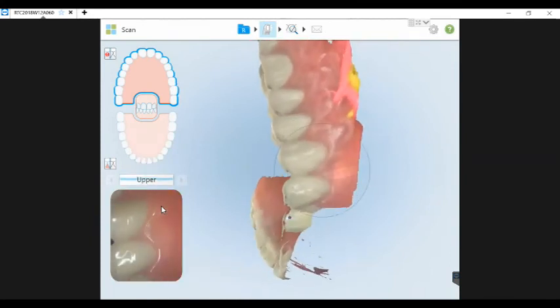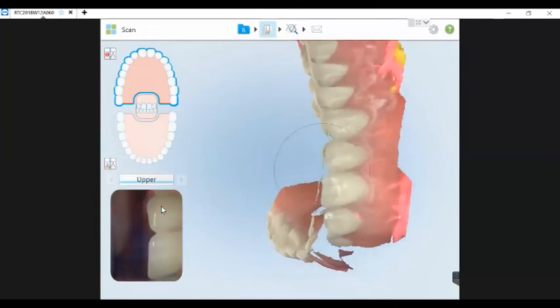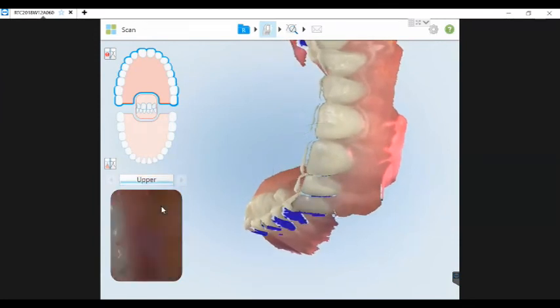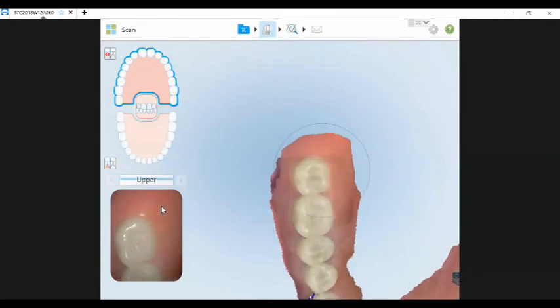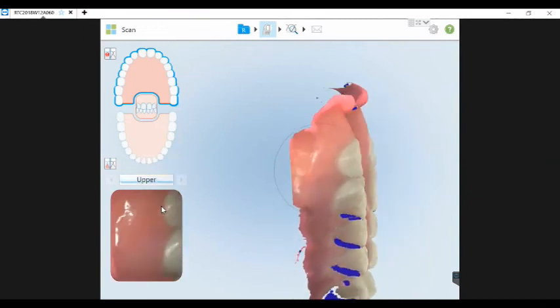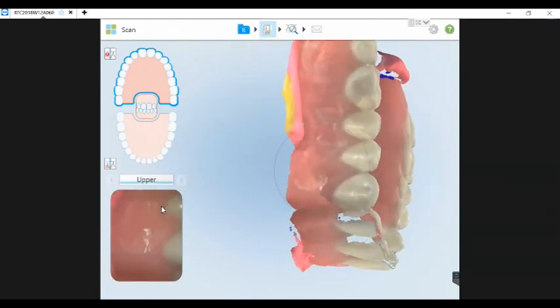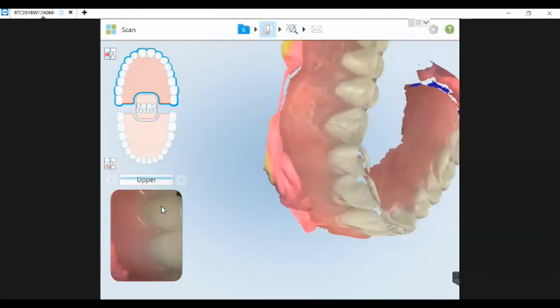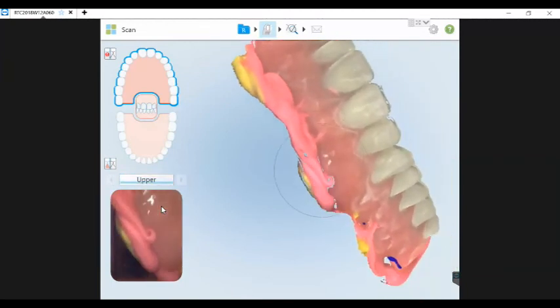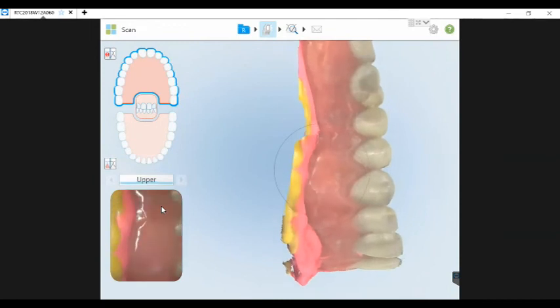So similarly, when we're doing occlusal, lingual, buccal on natural dentition, we're going to do occlusal, lingual, buccal on the denture as well. I would also like to add as well that there really is not any indicator that we have disabled the AI cleanup, aside from holding our fingers on the screen again to see the word enable. Yes, good point.